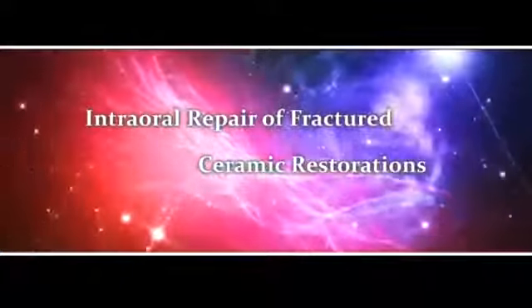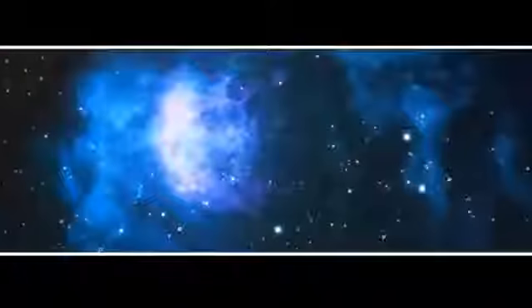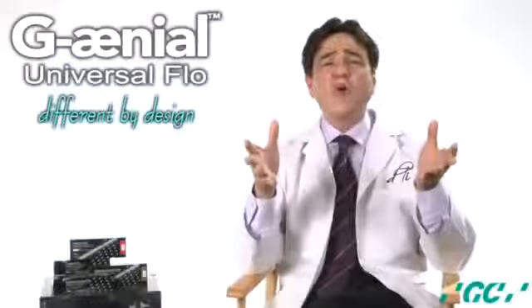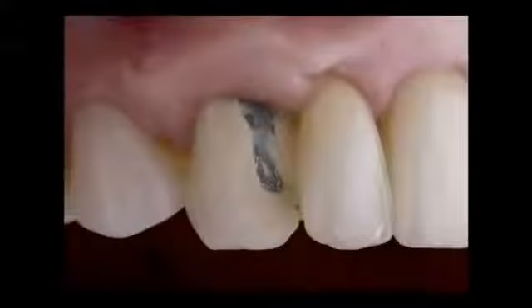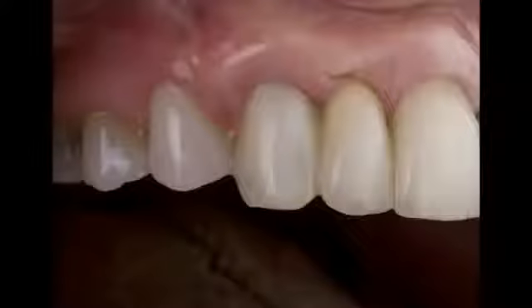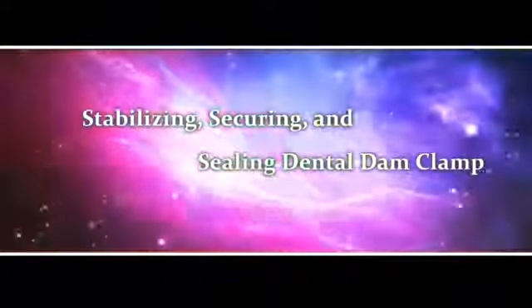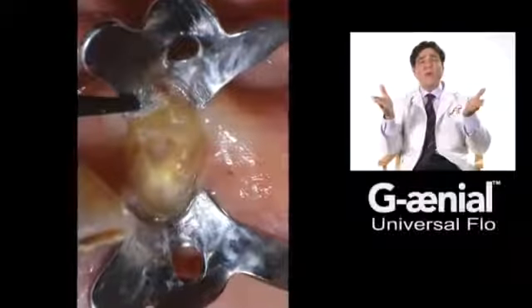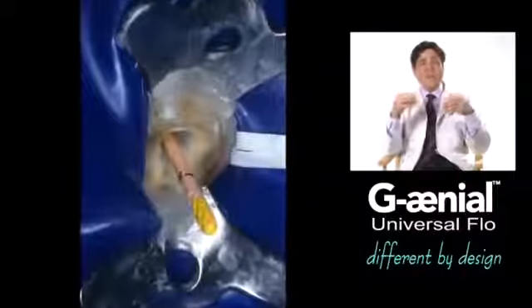These next-generation materials can also be used for transitional intraoral repair of fractured ceramic restorations. Application of flowable composite resins for the intraoral repair of ceramic restorations can increase the longevity and improve the aesthetics of fractured restorations and offer the patient and dentist a cost-effective alternative to replacement. Flowables can be used to stabilize, secure, and seal the dental dam clamp prior to procedure. Endodontic and adhesive procedures require proper isolation, and these flowable materials can be used to stabilize, secure, and seal the working field.